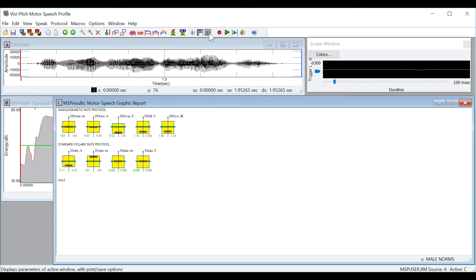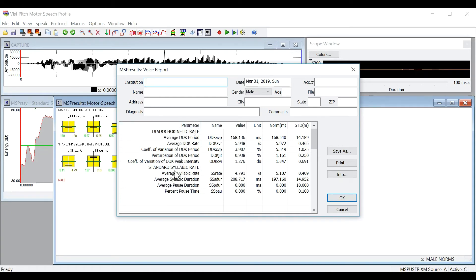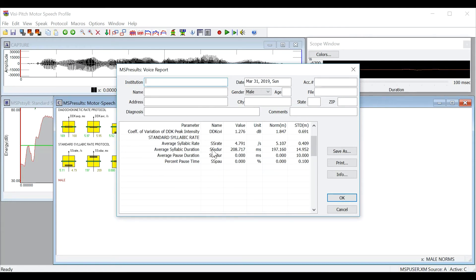Again you will see when I click generate report that the values are appended so now here you can see diodokinetic rate as well as the appended results for the standard syllabic rate. You can then repeat this process for all the protocols to generate a final report with all of the results in one place.